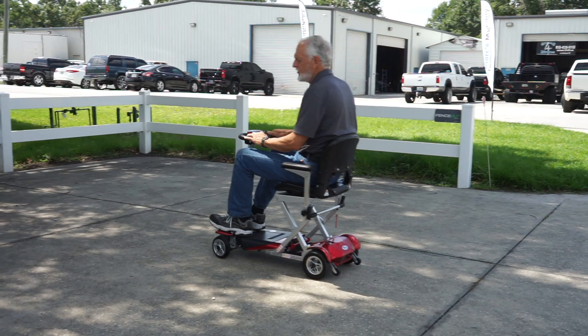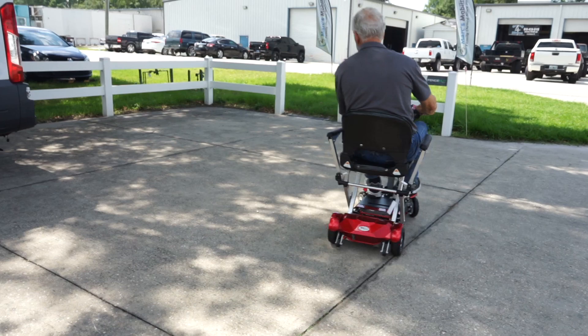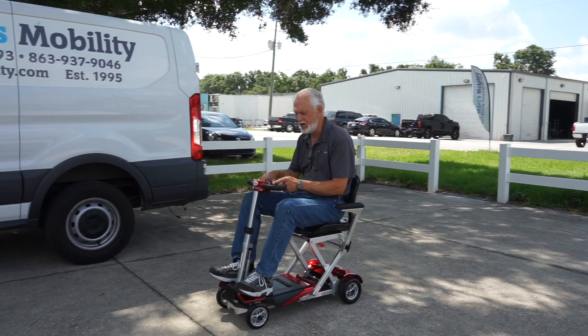This is your turning radius — so if you're going to turn in a circle, this would be the smallest turning radius you can do right here. I have it on full speed right now. If I bring the speed all the way down to slow, this would be the slow speed — you can't get in too much trouble at that speed. You can adjust the speed from almost not moving to 3.7 miles an hour.